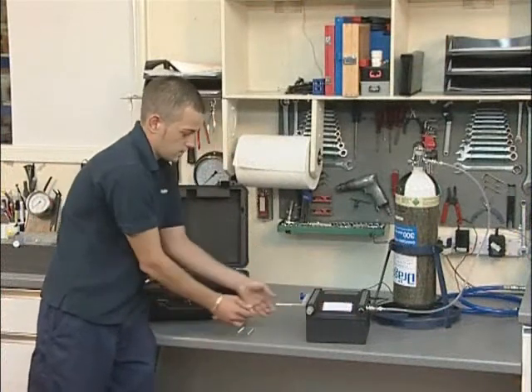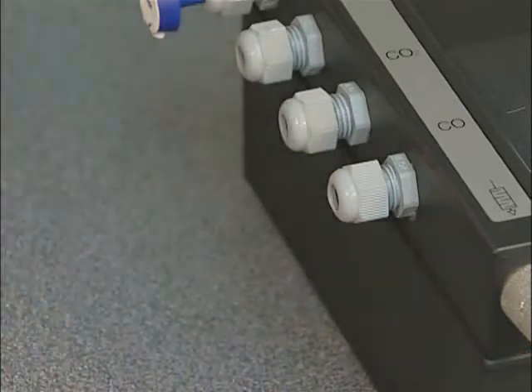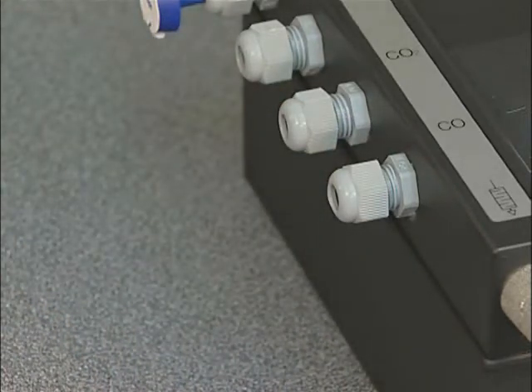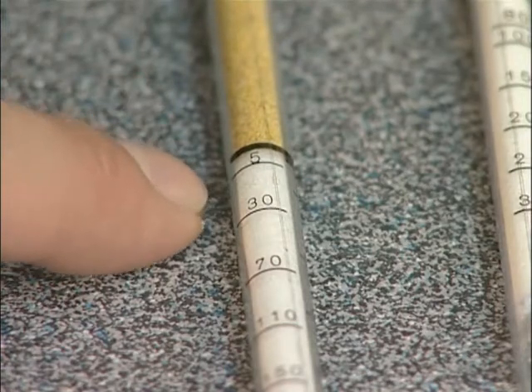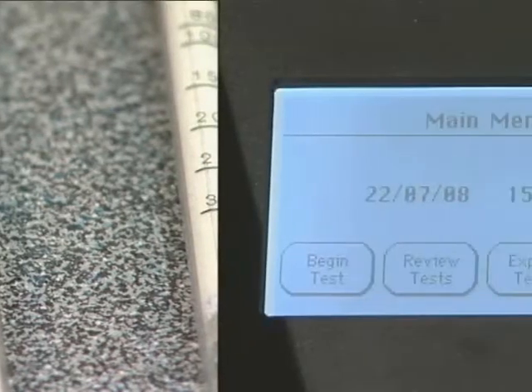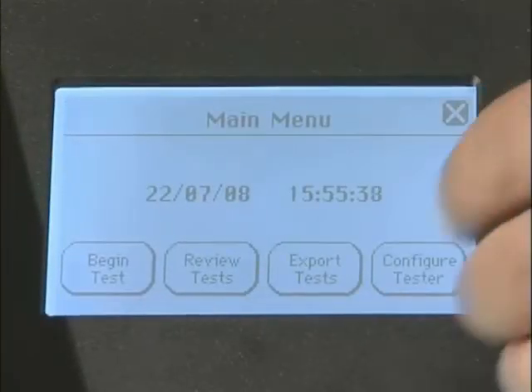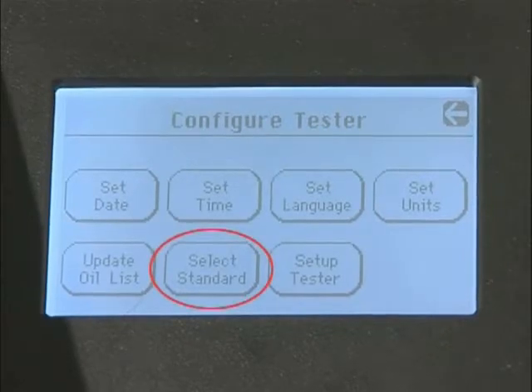If the test sample contained carbon monoxide, a greyish stain will be present at the start of the white crystals on the CO tube. The extent of this must not be greater than 5 ppm for the UK and 15 ppm for the European standard EN 12021. You can choose whether to test against UK or European carbon monoxide test limits in the configure tester menu.